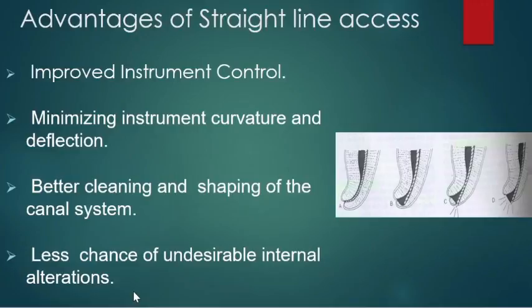So, straight line access will increase the operator's ability to manipulate files in as many areas of the canals as possible without changing the internal canal anatomy. It will also help in better shaping and cleaning of the canal system with less chance of ledging, zipping, or transportation.